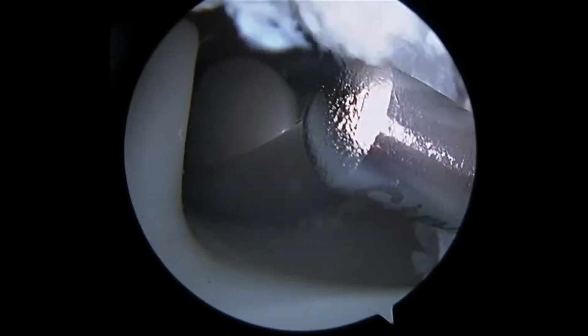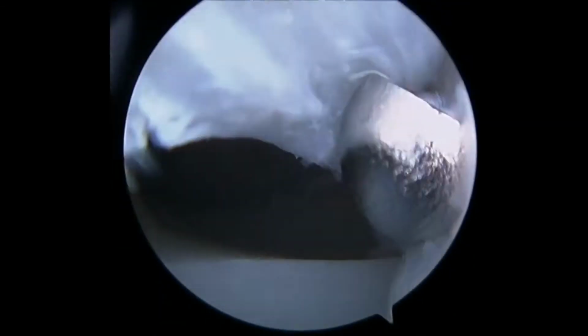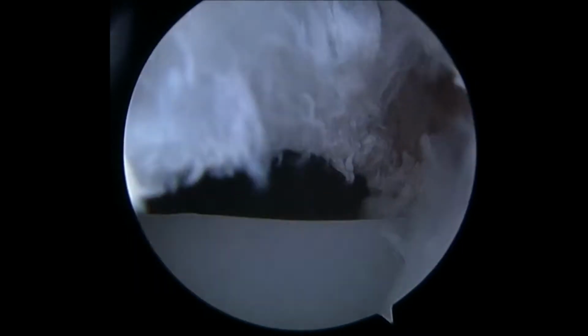So we ended up with an arthroscopic surgery, and I want to show this case because I just want to highlight how sometimes when people have some problems with their total knee replacement or any kind of knee replacement, they don't necessarily need to have it redone. Sometimes we just have to go in and clean up scar tissue. So this is an arthroscopic surgery of the knee. I sped the video up so that it shortens the video. So this is like 3 times faster.